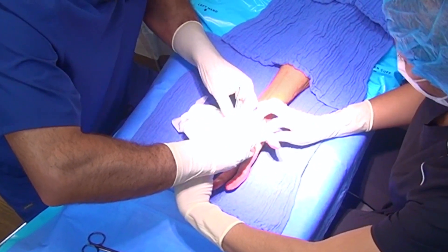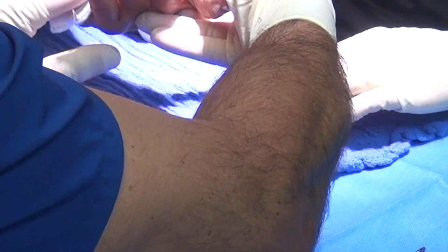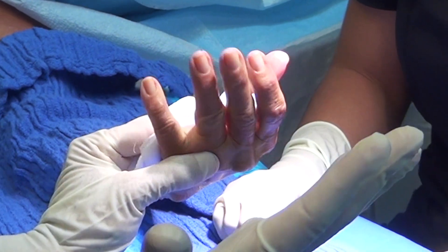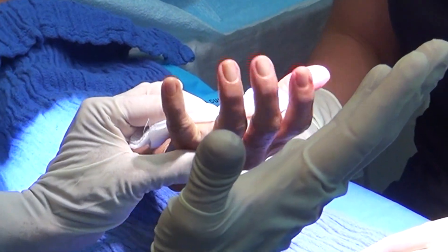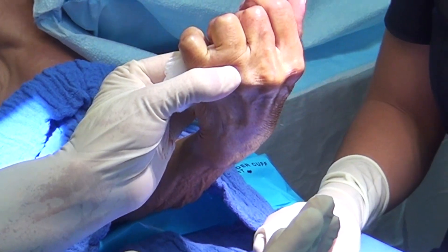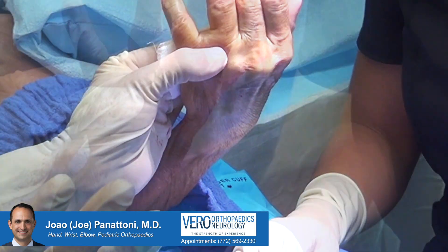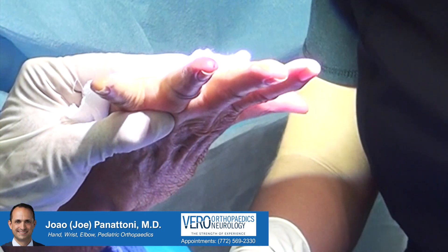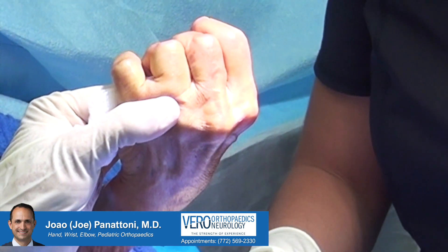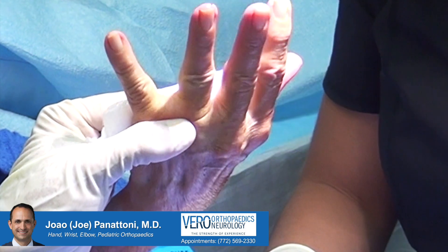Once I have a clear vision of the pulley, I can open that to free the pressure on the tendon so the tendon will be able to glide again. I need you to try to make a fist right now — all the way down — now open. Make a tight fist. How does it feel? Does it feel like it's catching still? No? You're feeling good, all right.